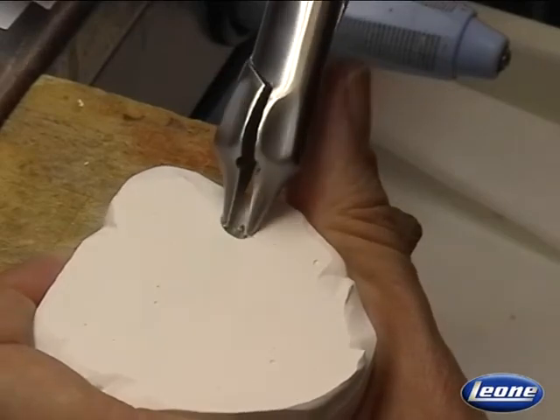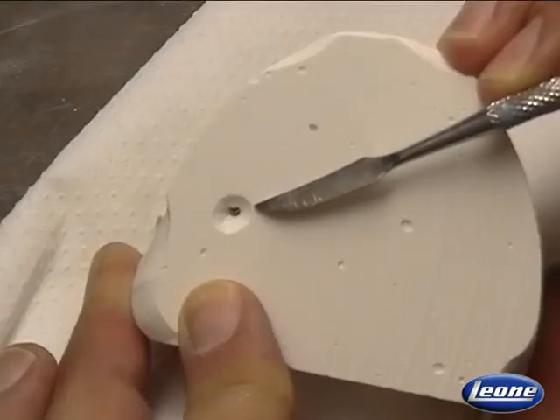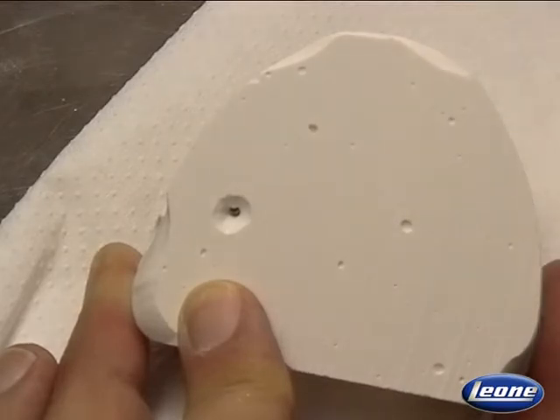As you can see, we have created a dental cast having on the back an access channel to the analog, which makes it easy to remove the abutment from the analog, after having activated its Morse taper connection.